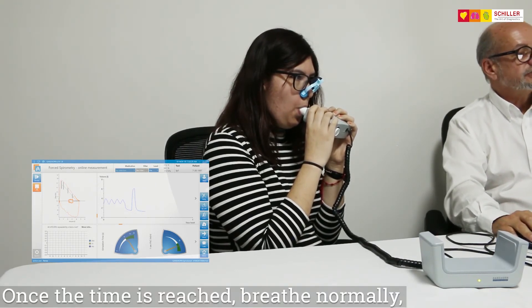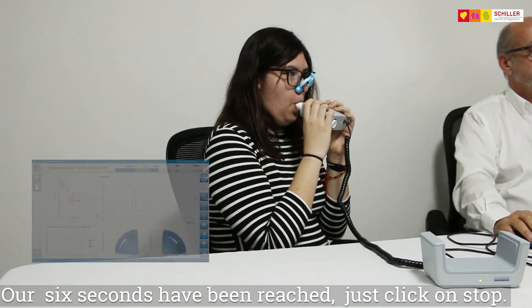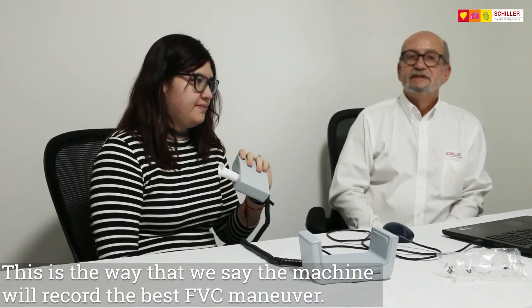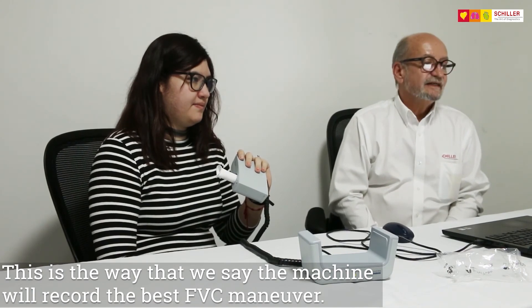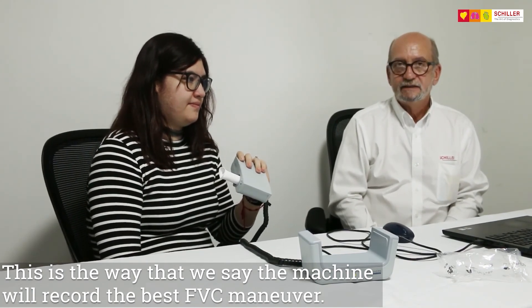Once the time is reached, breathe normally. Our six seconds have been reached. We just click on Stop. This is the way that we say the machine would record the best FVC maneuver. It's over.